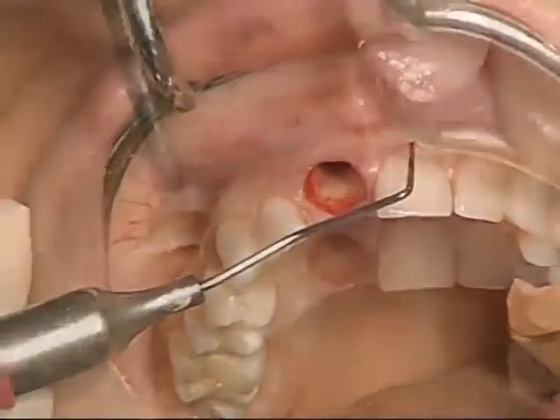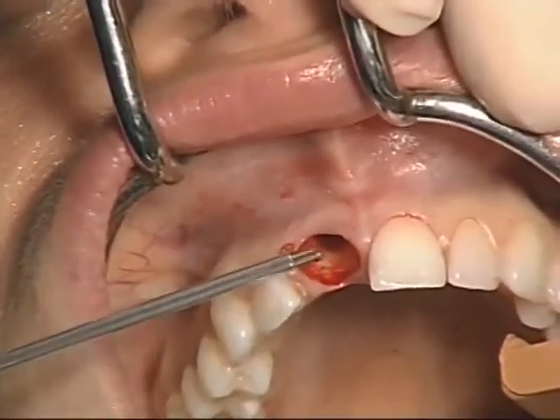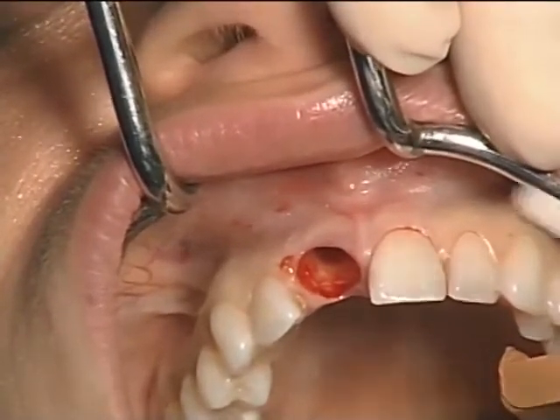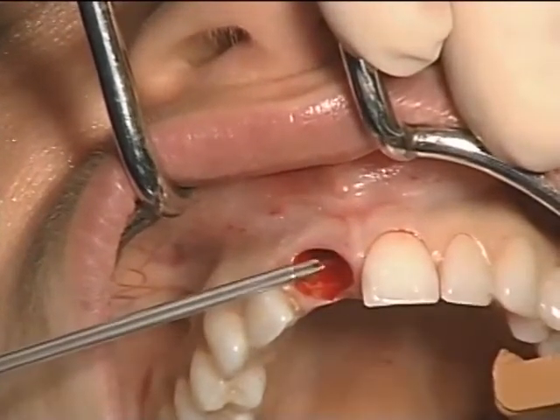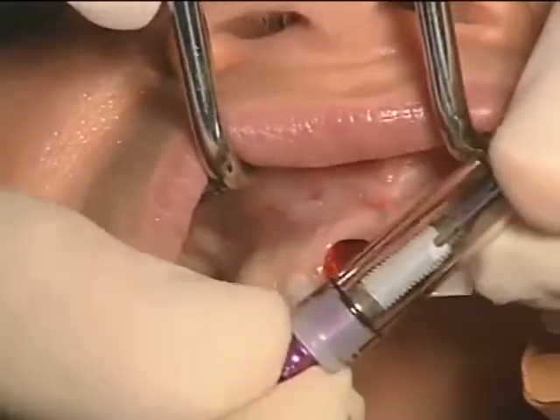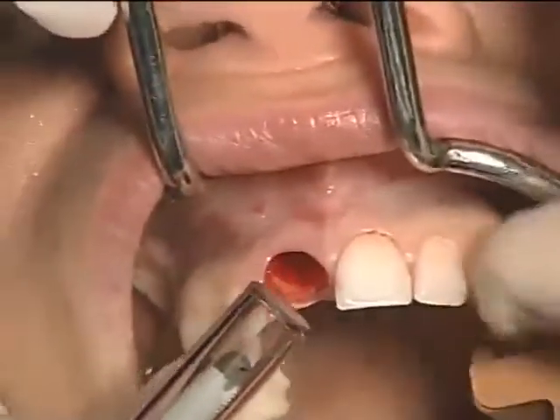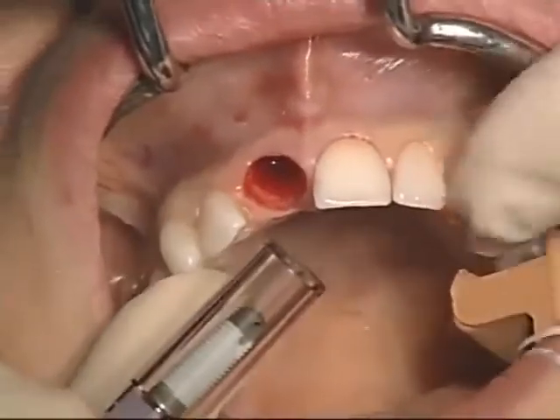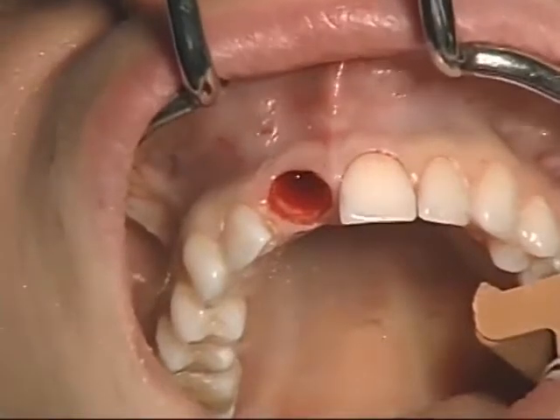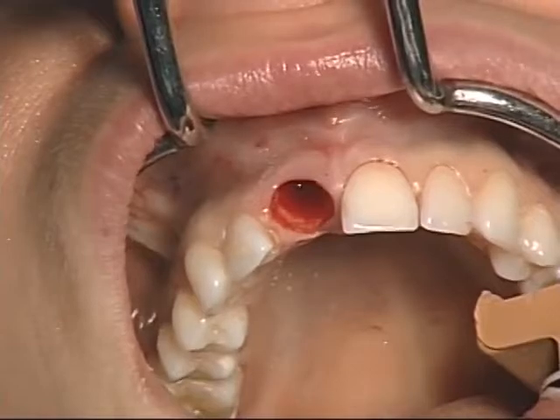Now we will be applying platelet-rich plasma into the osteotomy site prior to implant placement to help stimulate the healing of the soft tissue and bone around the implant. And that precedes implant placement. The implant we'll be using is a 4.7 millimeter by 16 millimeter tapered screw vent from Zimmer. The implant is removed from its vial, its surface is coated with platelet-rich plasma, and then the implant is inserted into the osteotomy site.